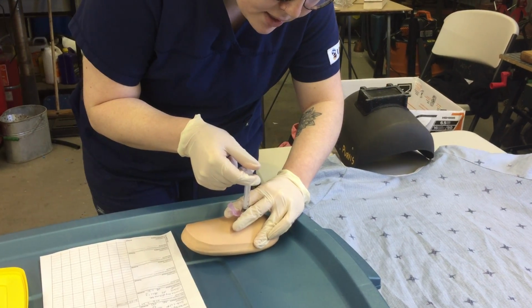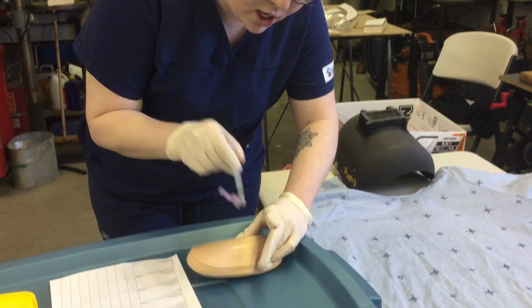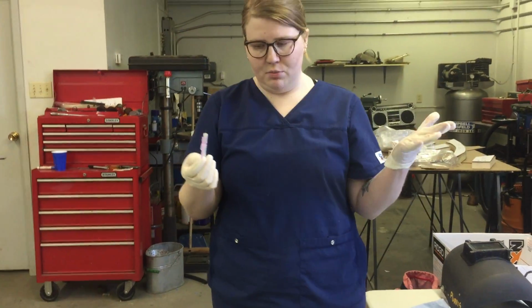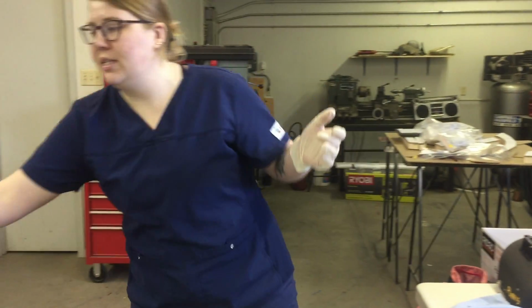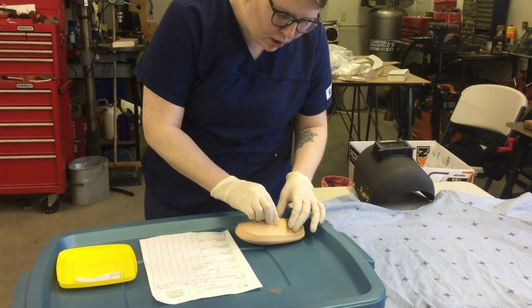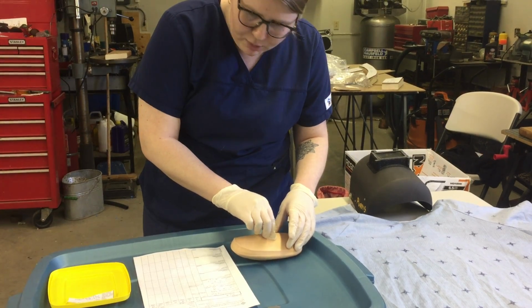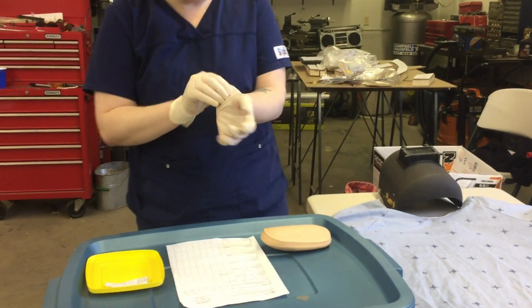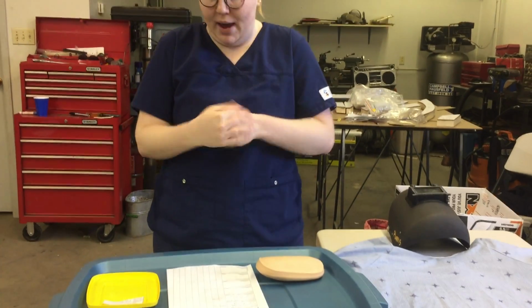at a slow and safe pace. I'll wait a couple of seconds. Once I'm done injecting, I'll remove my stabilization. I'll remove the needle. I will remove my pinch. I will activate the safety mechanism of the needle, and I will discard this in the sharps. After I've done that, I'm going to hold my cotton ball onto the patient where I've injected for about 30 seconds to get any blood or anything. After I've done that, we're going to say that was about 30 seconds. I'm going to remove my clean gloves and throw those in the garbage, and I'm going to perform hand hygiene.